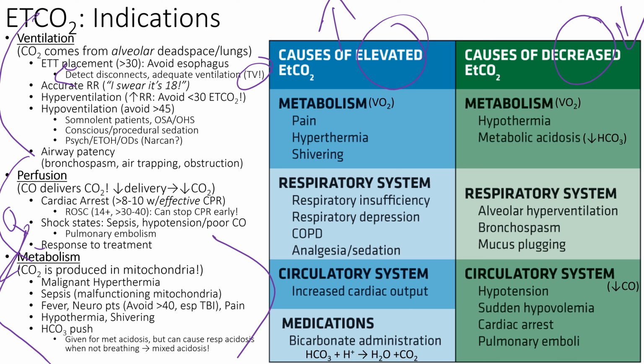So if your tidal volume was set at 400, and your ventilators are smart, it will say, I accept your number, but it's not my reality right now. I'm going to adjust it based on the pressures in the chest, right? And the pressure in the chest keeps going higher and higher. It's not going to deliver 400 because it's smart about it. It'll deliver like 200 or 250. And you can see over time your end-tidal CO2 start going up. It's like, why is that happening? And you can look back at the tidal volumes and see they were dropping.